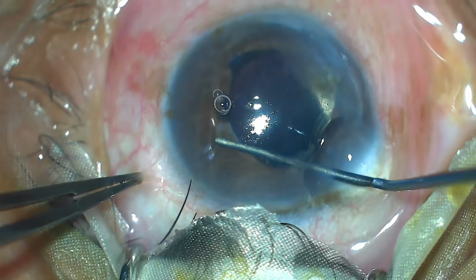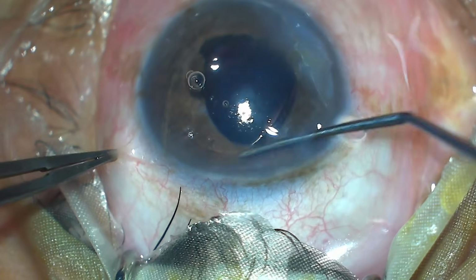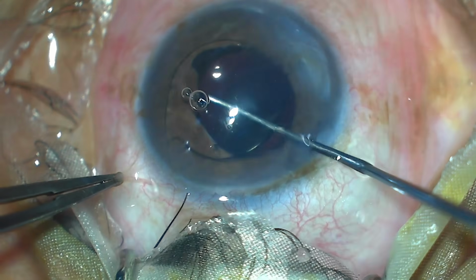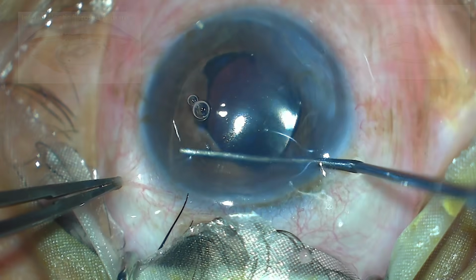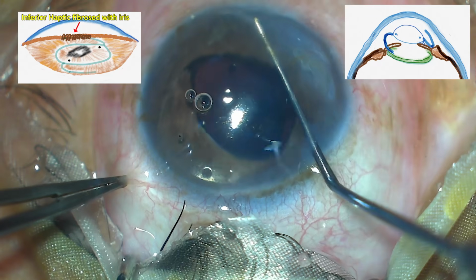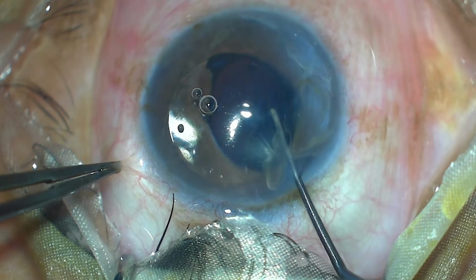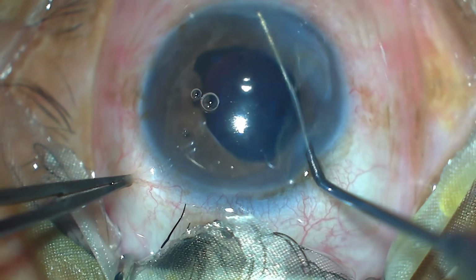A dialing instrument was introduced at the superior optic haptic junction of the PMMA IOL to dial it clockwise to make it free from the superior angle. But rotating the IOL further, it was noticed that the lower haptic had perforated the iris and was densely fibrosed with it at the inferior angle. Repeated dialing remained unsuccessful.